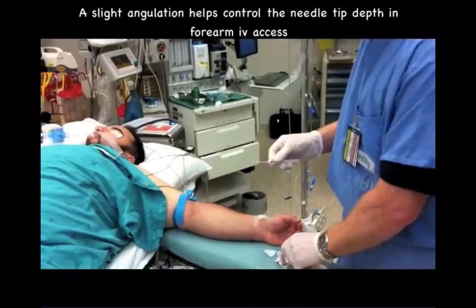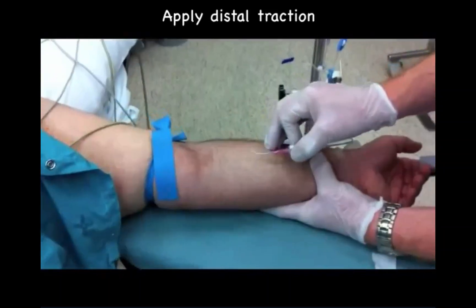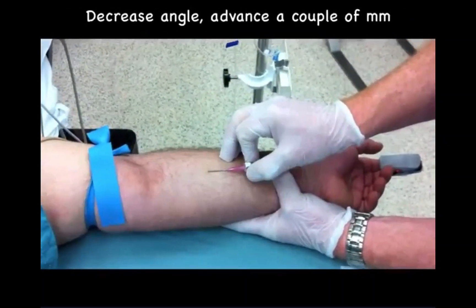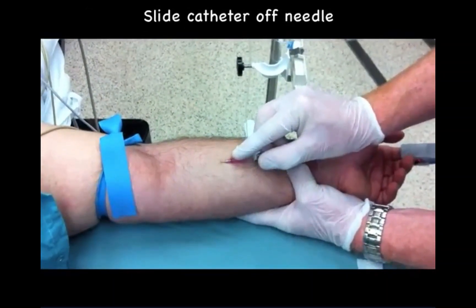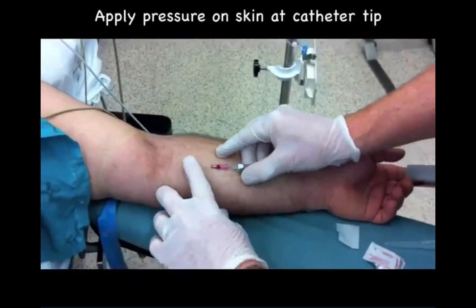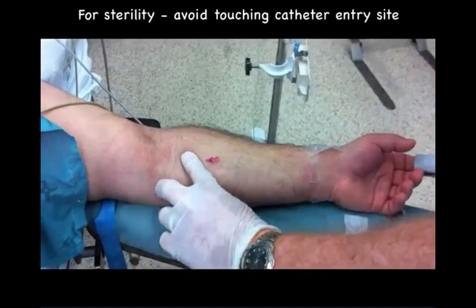It is essential to immobilize the vein with the other hand applying distal traction on the skin. The needle tip enters the skin directly over the vein. It is important to avoid applying a downward compressive force, as this may collapse the vein. Once the catheter is advanced into the lumen, the catheter is secured as previously described. Note that if the BD catheter does not have blood control technology, proximal vein compression must be applied prior to retracting the needle to prevent blood spillage.